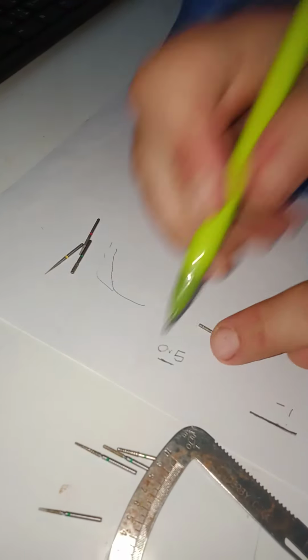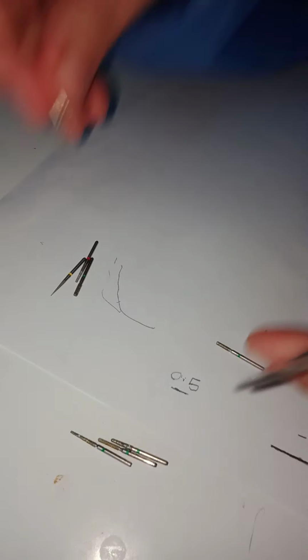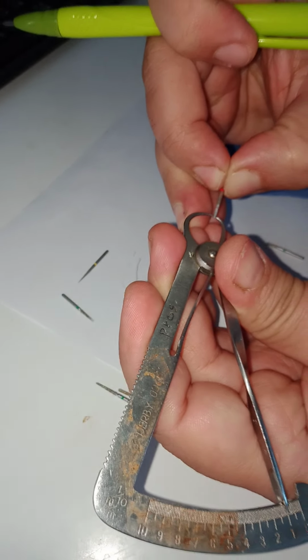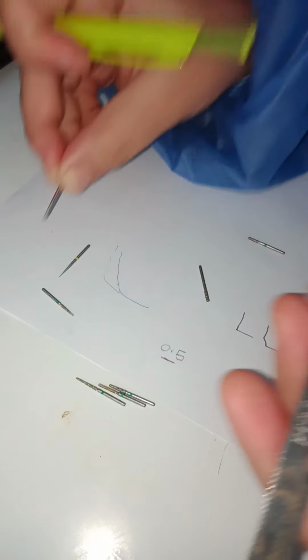But once more, because I want to only create 0.5, I either choose from the beginning a bur that is 0.5 at the tip. So is this a 0.5? No, this is a 1 millimeter. I'll choose something thin. This is thinner. Let me see if this is a 0.5. Okay. At the tip, it's a 0.9 or 0.8.